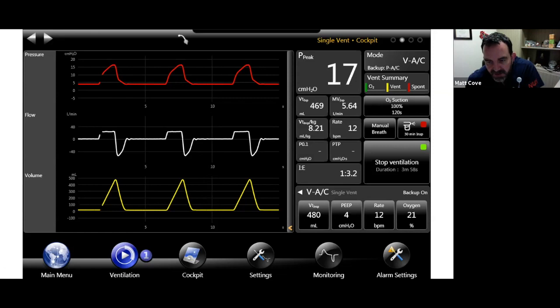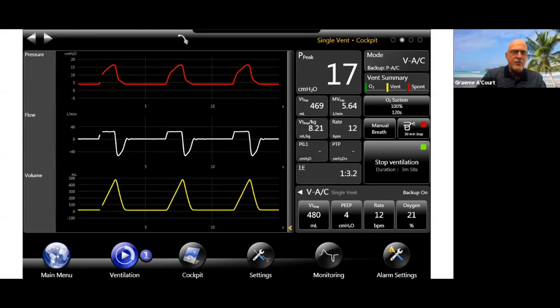I'm not familiar with, you have to define PTP, I'm afraid. Pressure time product. When the patient's triggering this area down below here, it's how long it's taking to get back to the same point again, from like 5 of peak back to 5, for example, whereas the P0.1 is really the steepness of demand. So it's like a neural coupling.